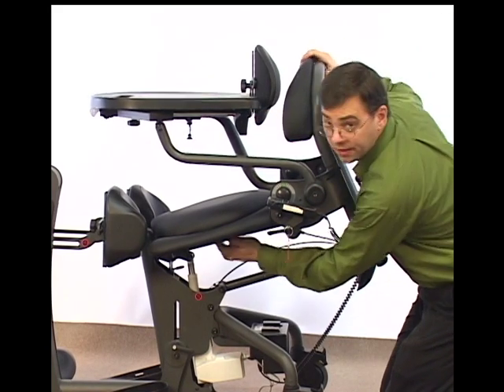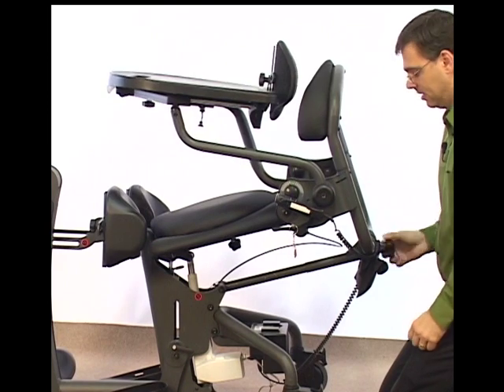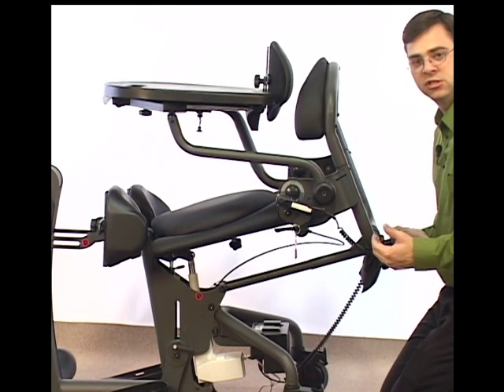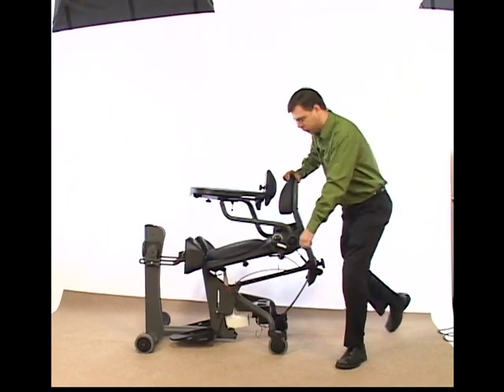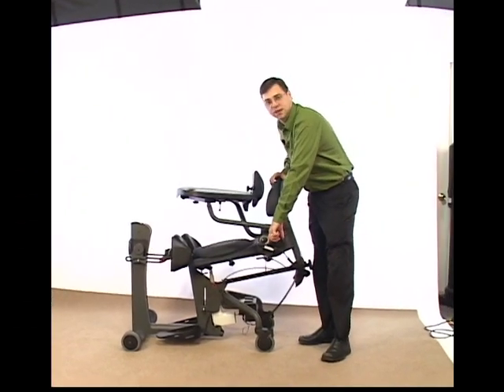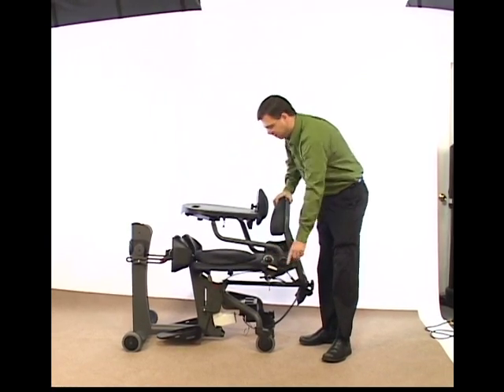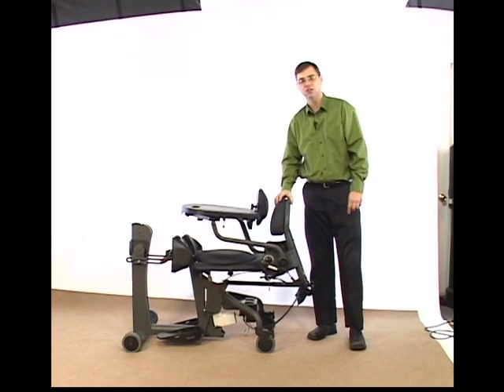Once it's level, I can make another inch adjustment by pushing the button and continuing to lower it back. So far, I've adjusted it two inches back. Once we have the seat depth set, let's drop the Easy Stand back down into a flat, seated position. This also allows us to check our back angle and make sure that we've made the adjustment properly.